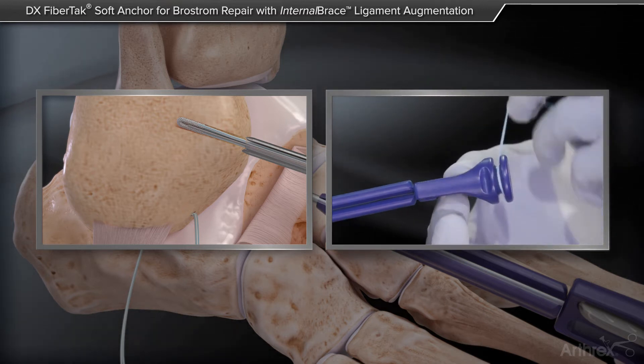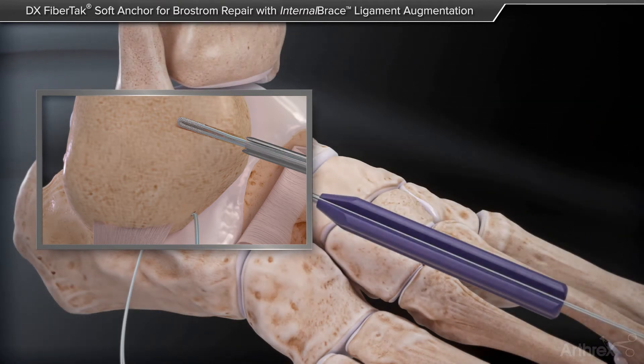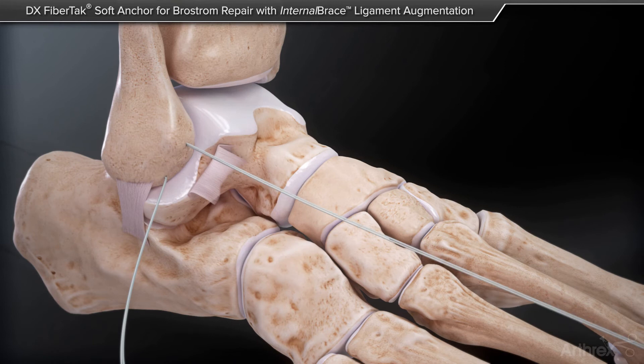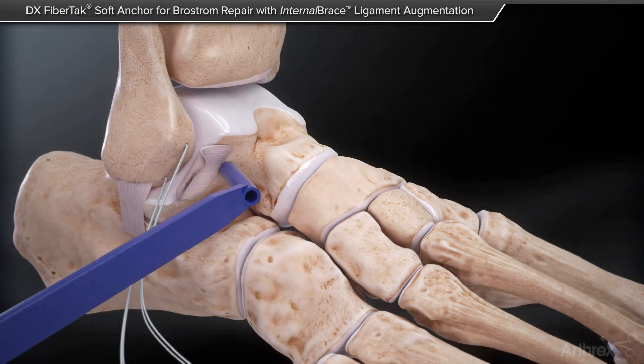By creating a smaller hole, there is less post-operative pain, and the footprint is also smaller. You can see, if you pay attention to the tip with axial traction, the tip of the anchor becomes larger, preventing pullout.